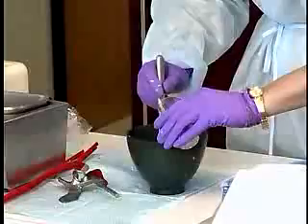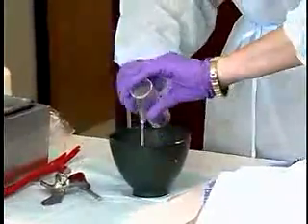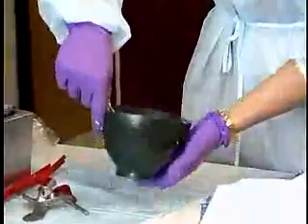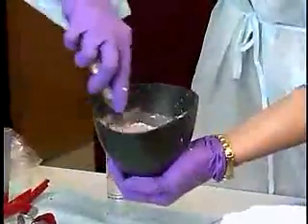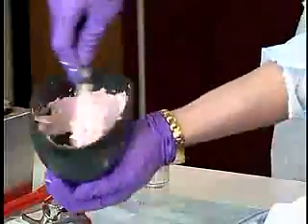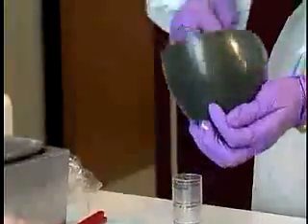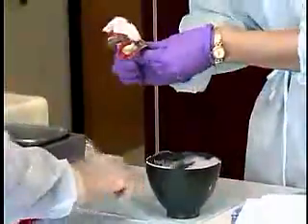The alginate is mixed following the manufacturer's instructions. Then load it into the stock tray.